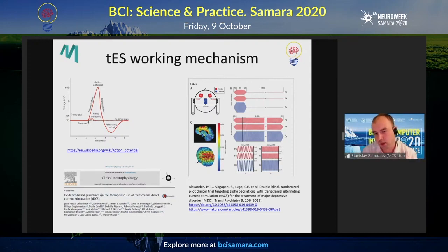If both of our electrodes are on your head, from that point of view, one part of the brain will be excited, another one will be inhibited. When we only want to excite a part of the brain, you can install the cathode where there's no brain.